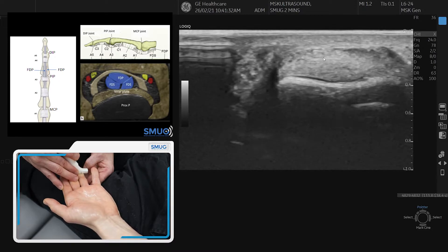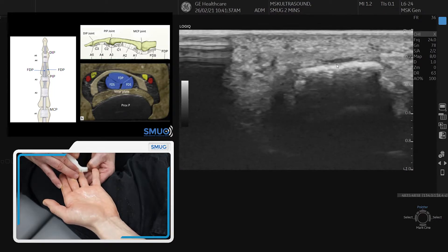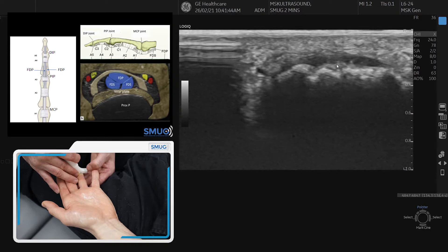In a moment the profundus will attach to the bone, which is the last bit. It does require constant adjustment of the small hockey stick probe, and that's how we do it in cross-section — transverse.